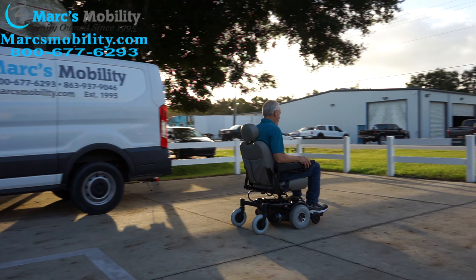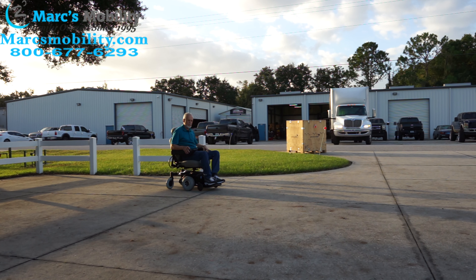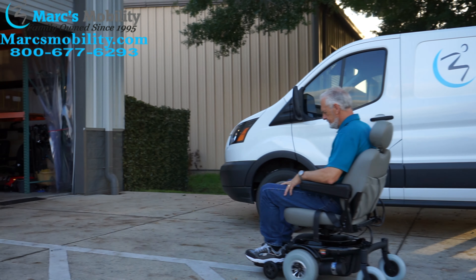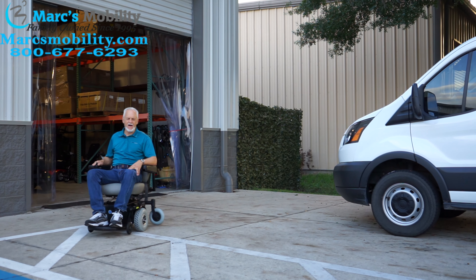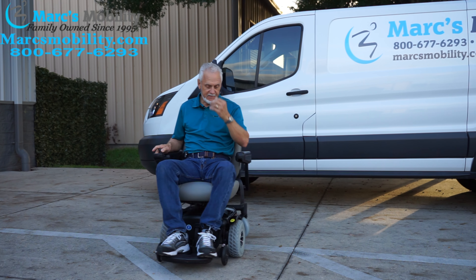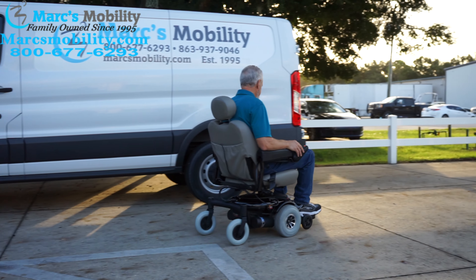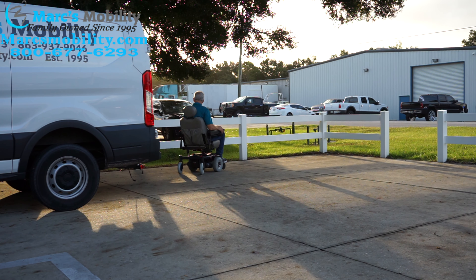The chair has a built-in charger right here. The cord is stored inside the charger and also in the back pouch. All you have to do at the end of the day is plug the cord into the wall. Some people run the cord all the way to the front near the joystick so they can reach it more easily — you can do that too.